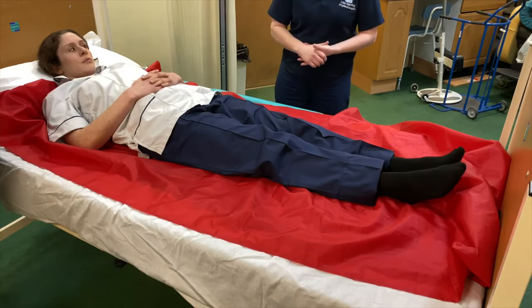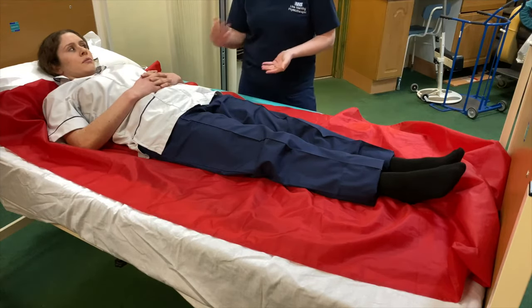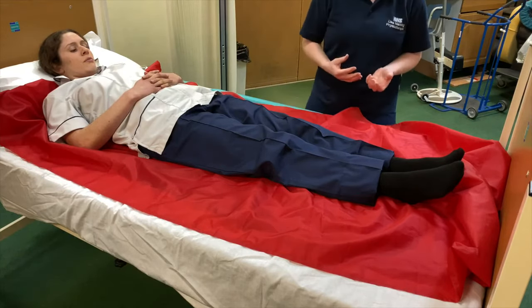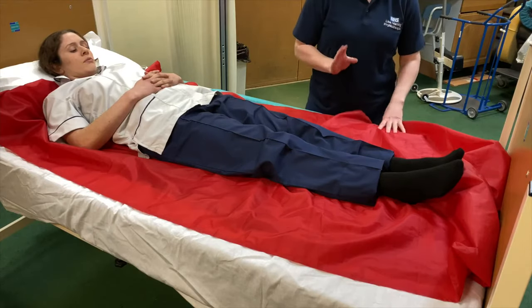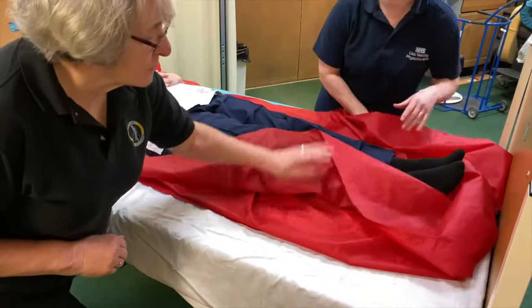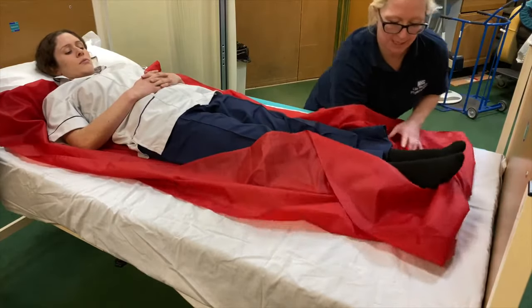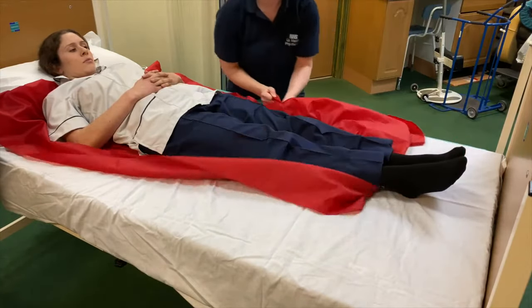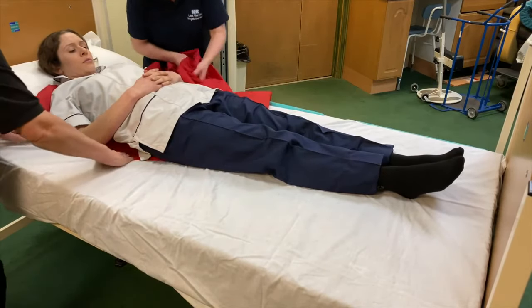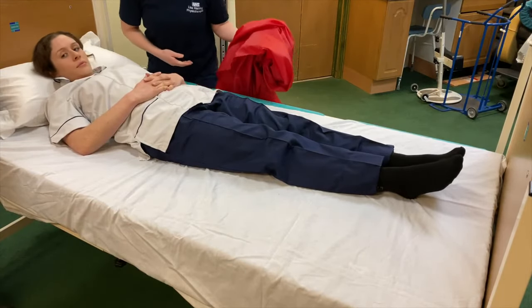So first of all, we just need to explain to the patient what we're going to be doing and how we're going to be removing the slide sheet. And then after that, we get a nice stable base. What we're going to aim to do is take the slide sheet from under the lightest part, and take the bottom layer from the opposite side. So we're going to pull it through, pull it towards us, and work our way up the bed, checking that the patient's okay at all times. And then the slide sheet's removed.